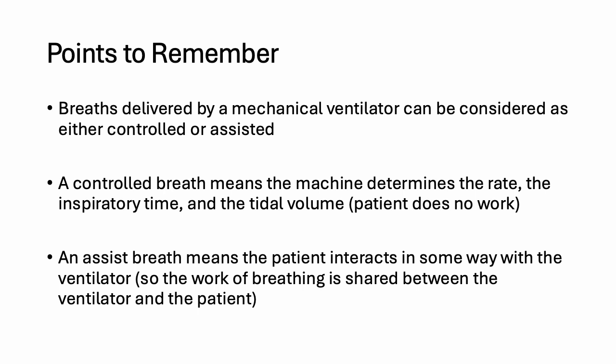Compared to when the patient is on the spontaneous breathing modes, which means the patient can determine their own depth of breathing, how fast, how deep. Then when you get the patient to take a deep breath, and if the patient can follow commands and instructions, you can actually see the difference in terms of the exhaled tidal volume if the patient is on a spontaneous breathing mode.